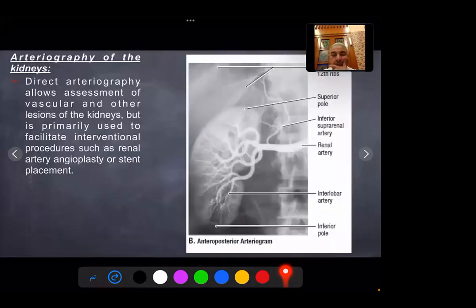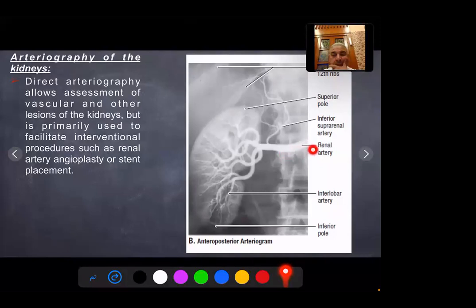Arteriography of the kidney: direct arteriography allows assessment of vascular and other lesions of the kidney but is primarily used to facilitate interventional procedures such as renal angioplasty or stent placement. The arteriogram shows the main renal artery, the segmental arteries, the interlobar arteries, and the arcuate vessels.